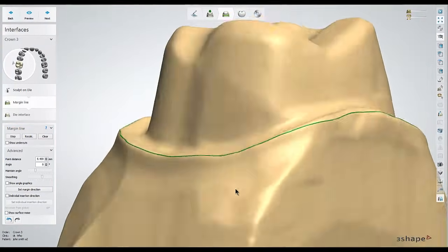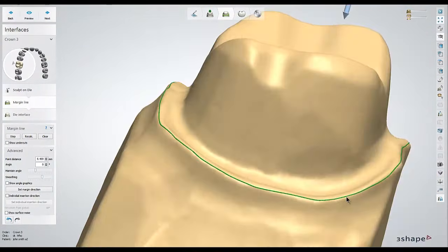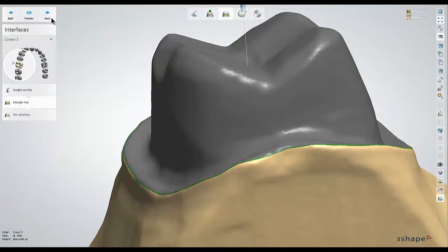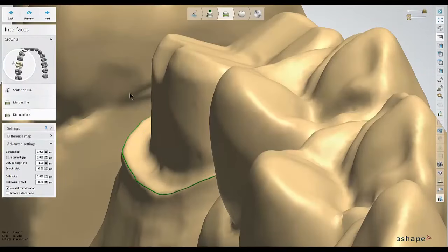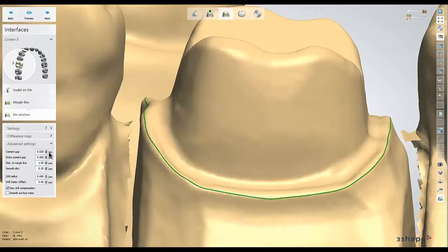If you need to get out of that mode, just simply right click on the line again and check the fast edit spline back on. We'll continue next until we get to the die interface step, which is where the software is going to apply the cement gap settings. As long as your doctor isn't requesting a slightly tighter or looser fit than normal, you can usually leave these at the default settings and continue next into the design stage.